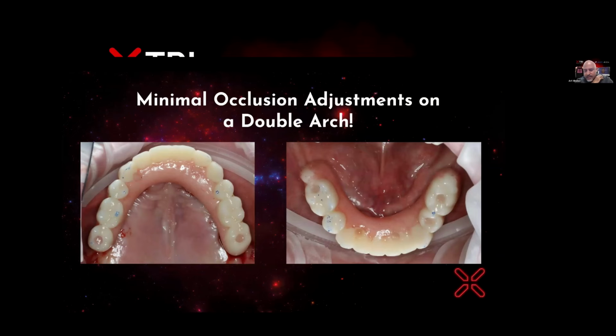It's so true. We provide design services at InstaRisa, and we get to see a lot of these records that come in, and we can plan the perfect smile, but it really is dependent on where the implants go. And then it's also even more dependent on which multi-unit abutment is selected. Something to keep in mind is that the next time you're doing an arch, and I did this actually, I timed myself from the time I placed my implants to the time I was done selecting my multi-unit abutments, because I pretty much freehand the majority, about 50-50. I got Yomi now, so I'm doing about 50% with Yomi.